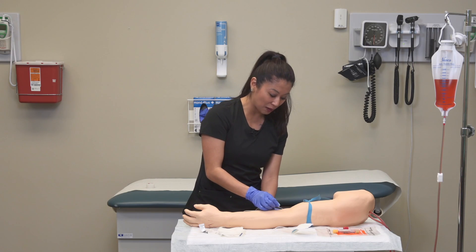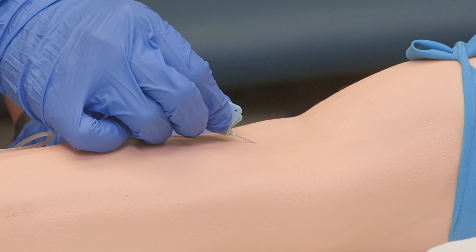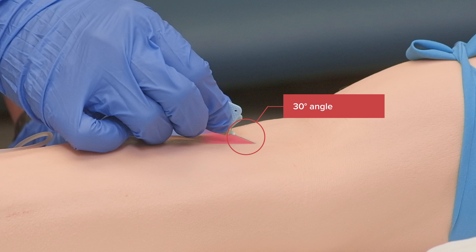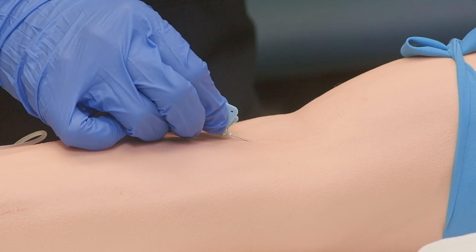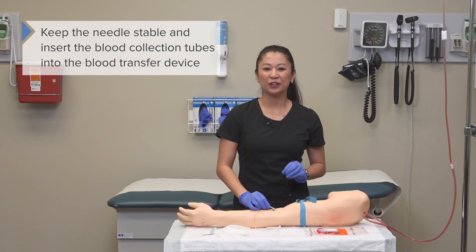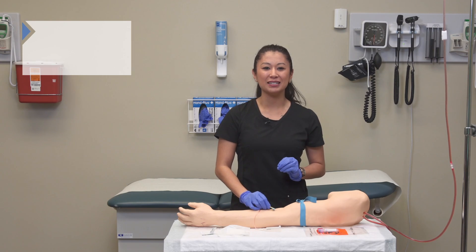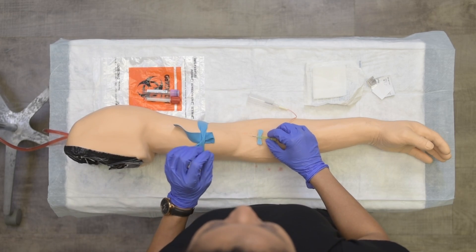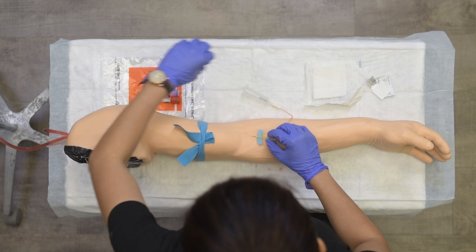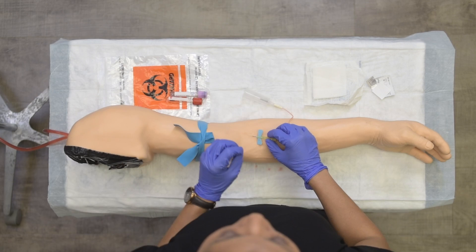With the bevel up, I'm going to access the vein. Once we've been successful in accessing the vein, do your best to keep the needle as stable as possible with your dominant hand. Then use your non-dominant hand to insert your blood collection tubes into the blood transfer device.